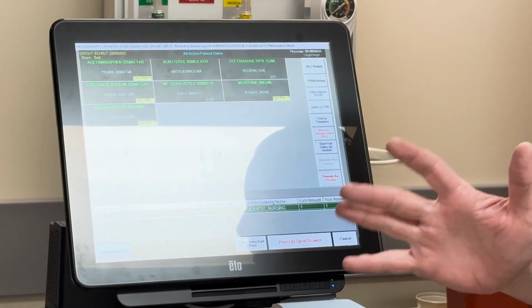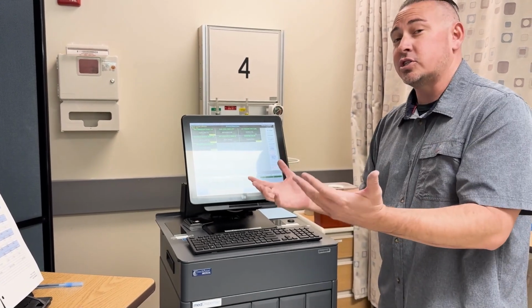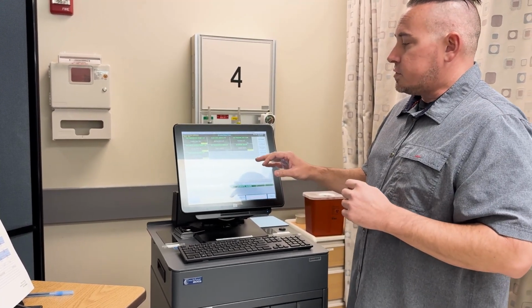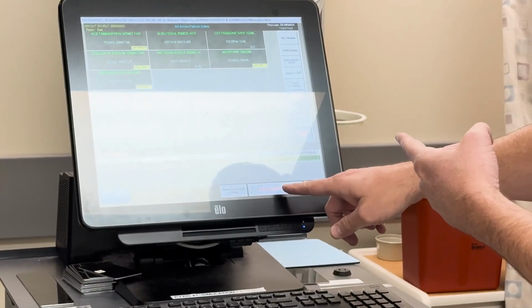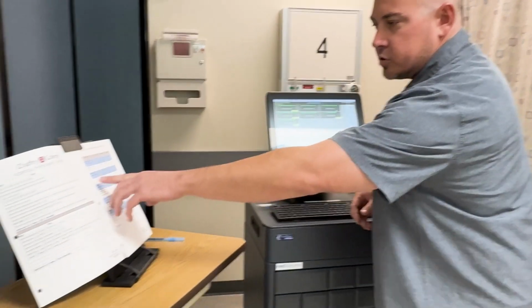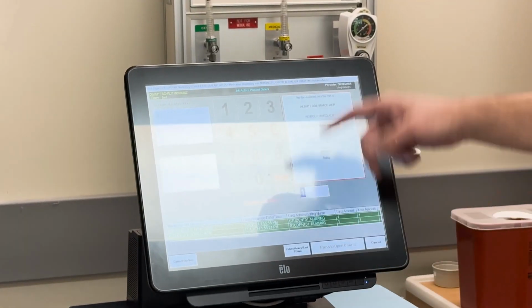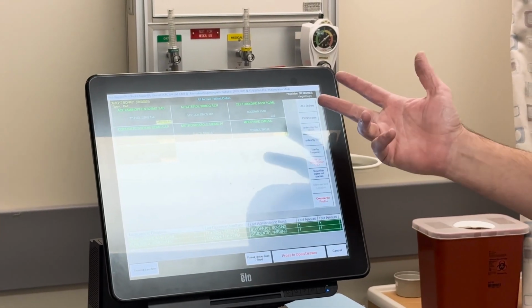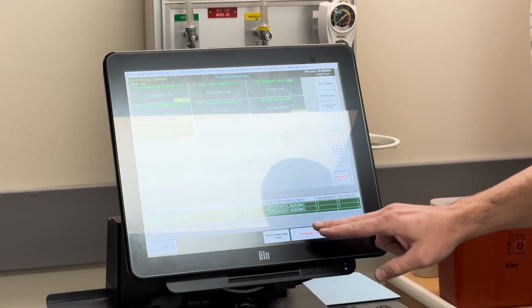It's like an Amazon cart, guys. Don't worry, it didn't disappear. It just got added to your cart, but you haven't hit checkout yet. It's okay, you still got time. Once you've selected all of the medications you want, you're gonna press here to open drawer. But hey, he had 2 medications, so I'm gonna select both of them. He also had his albuterol that was due, so I'm gonna find the albuterol, pick it. How many do I need? I know from my calculation it's only 1 inhaler. I hit OK. Again, it's been added to my cart. I'm now ready to check out.